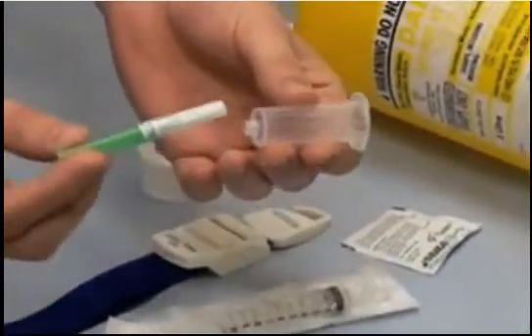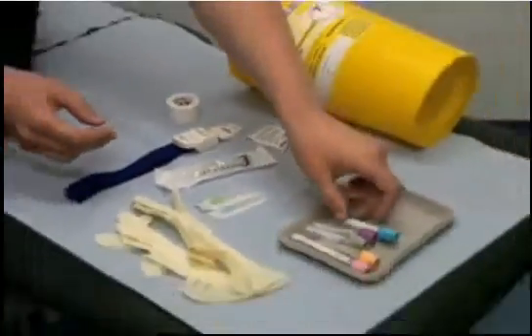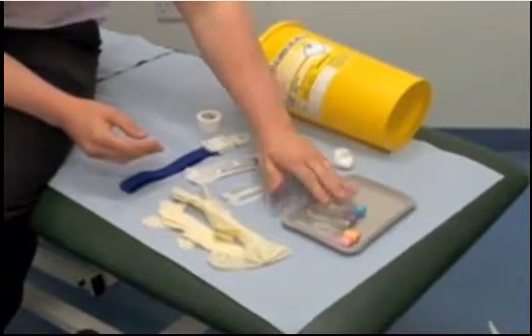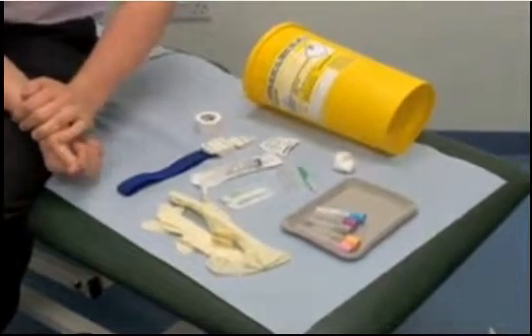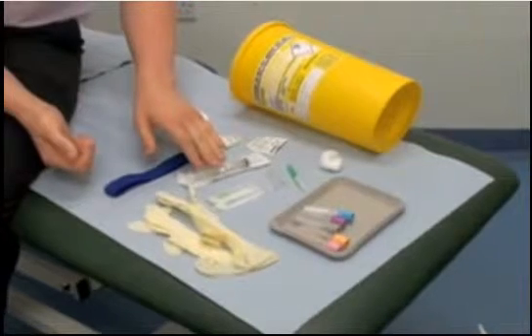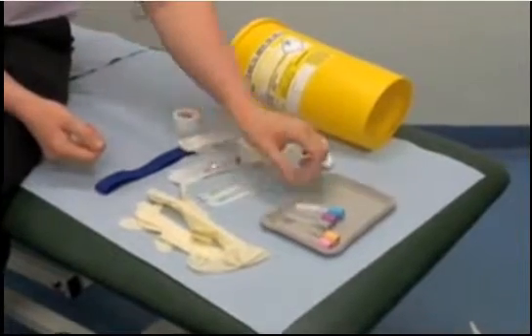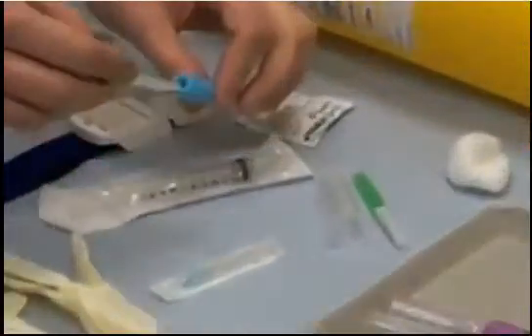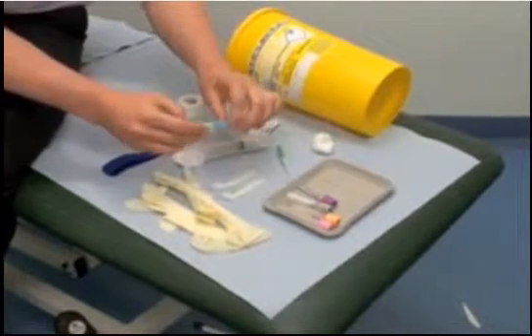An alternative system is the vacutainer. This has a needle on one side and a needle on the other that screws into the device. It then attaches to these blood bottles — also called vacutainers — which come in different colors depending on which blood test you want. The principal advantage of the vacutainer is a lower chance of needle stick injury, because once you've taken blood with a needle and syringe you have to transfer it into containers individually, risking a needle stick. With the vacutainer, the bottles pop on automatically and fill.